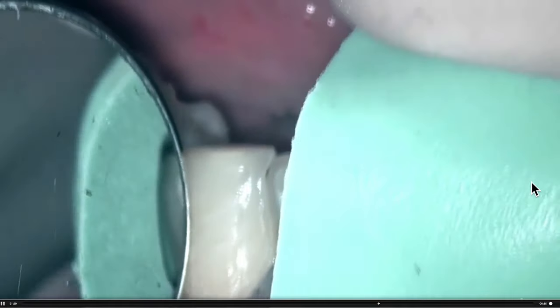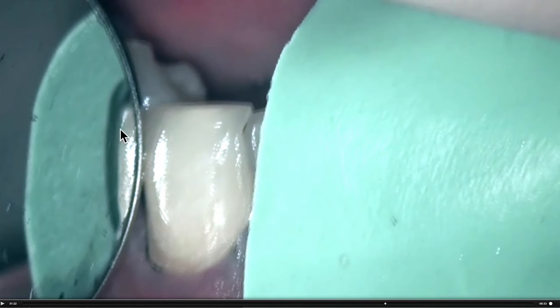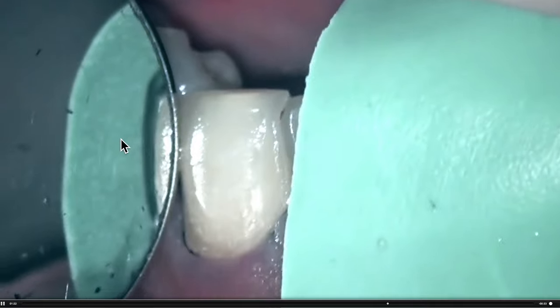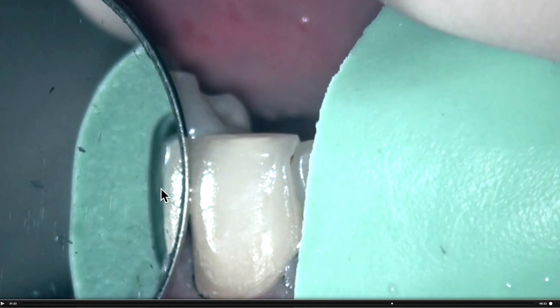Here now you can see this looks pretty good — we have the good amount of space, but what you're seeing here is that sharp edge. We have a sharp corner between the incisal reduction and the body reduction at the incisal edge.